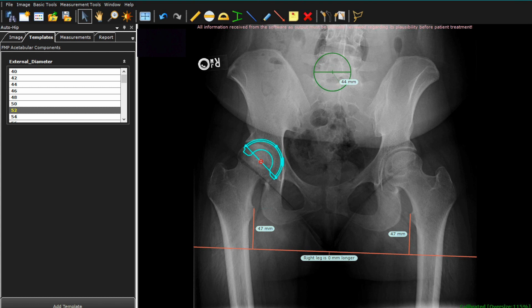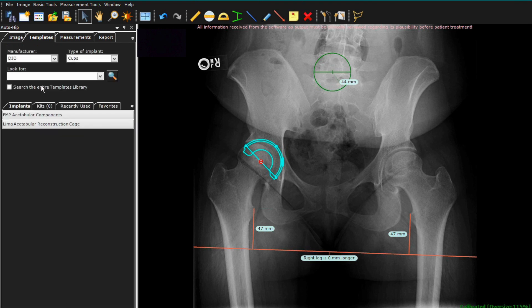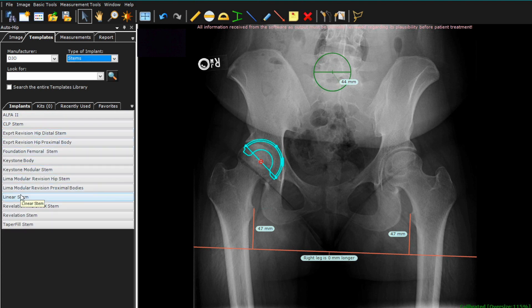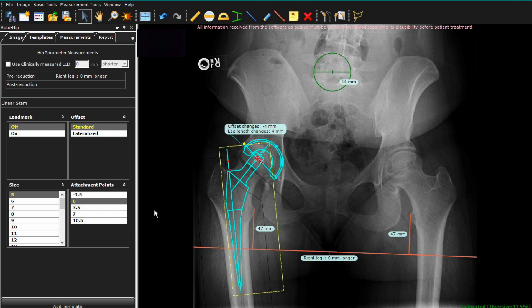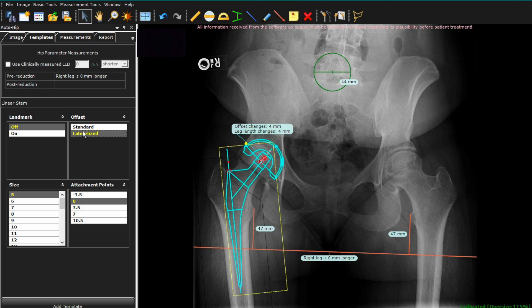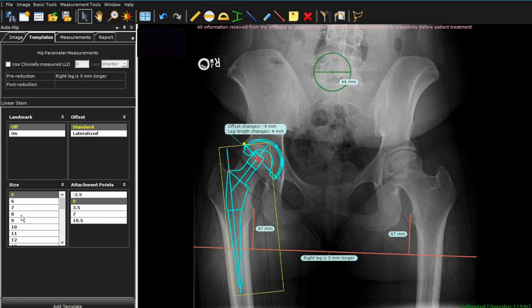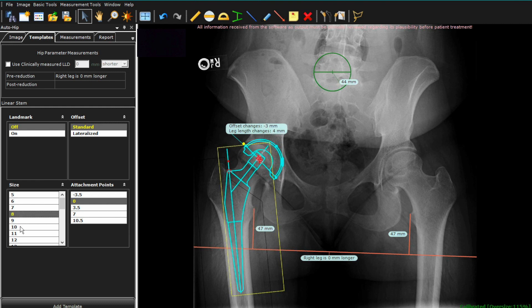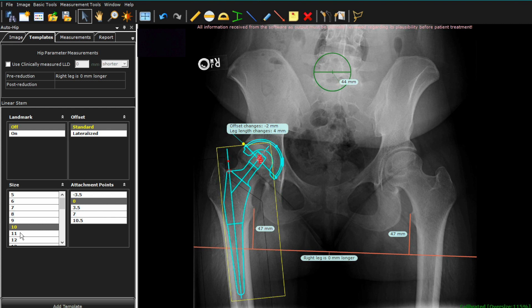We're now going to move on to the femoral stem, so we're going to add template and select our stem from the drop-down menu, just click on the stem of choice, and this will now drop the stem onto the radiograph. The stem is now shown in relative position in the proximal femur, and you can play with the standard or lateralized offset and see how that changes things, then select different size stems as well. You're looking for a good fit in the calcar — not too large, not too small — but filling up the calcar region. I'm going to have the attachment point set at zero, and then you can see what you're doing to your leg length and offset.